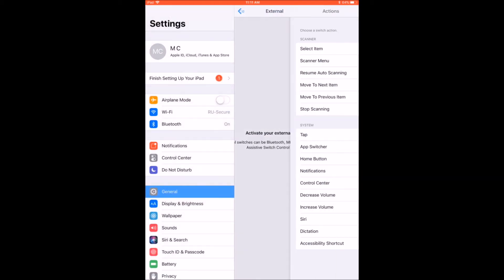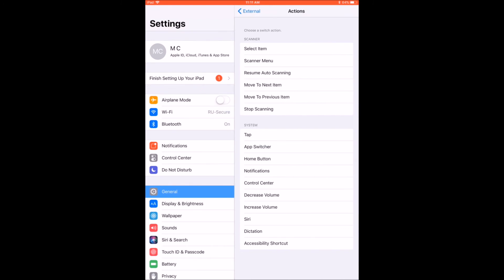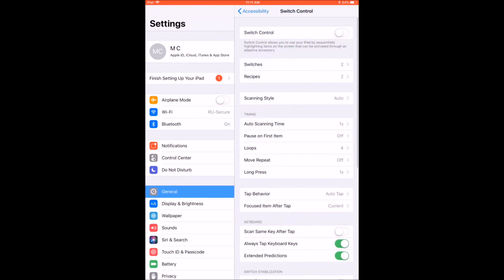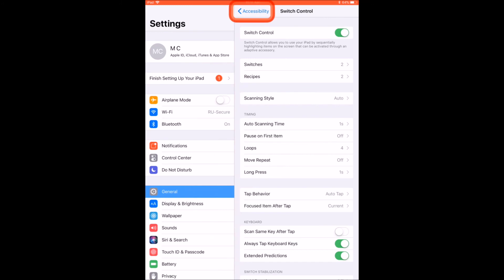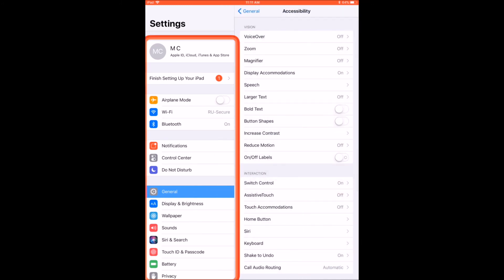Once you have added all of your switches, go back to Switch Control, and activate Switch Control by clicking on the On and Off Control. You will now see a box highlighting your option on the screen.